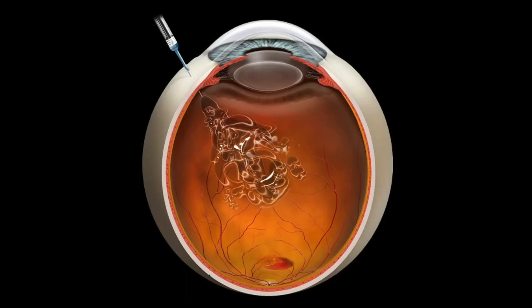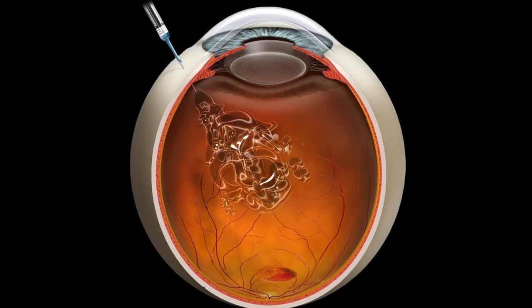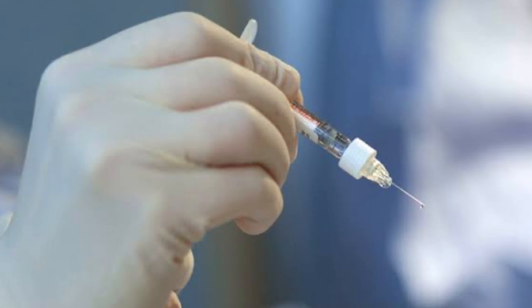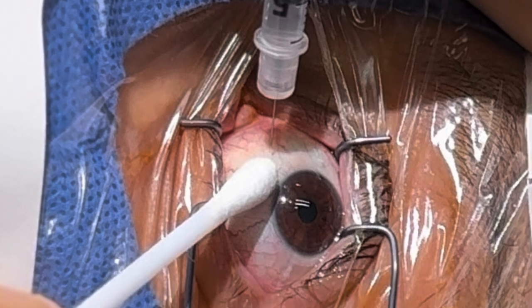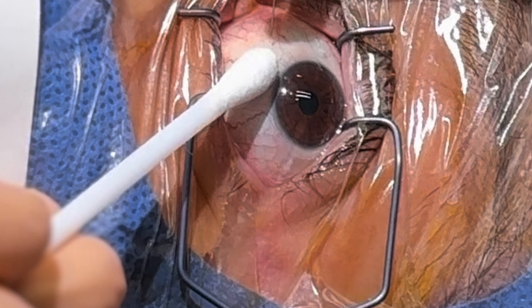In this video, I will show you how to administer intravitreal injections. I just want to emphasize that this is just one approach, my personal preference, although there may be variations in your technique. As I describe the video, I will walk you through step by step, discussing current evidence and explaining why certain methods are chosen, as well as alternative approaches you can consider in your daily practice.